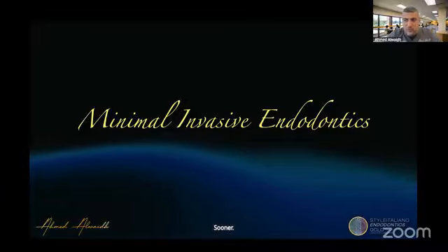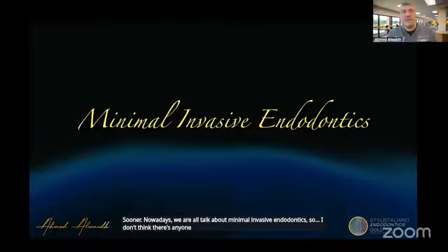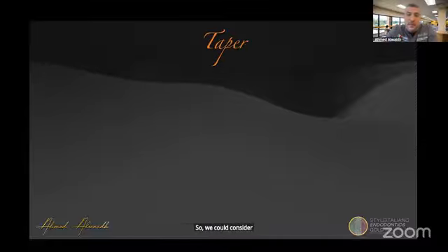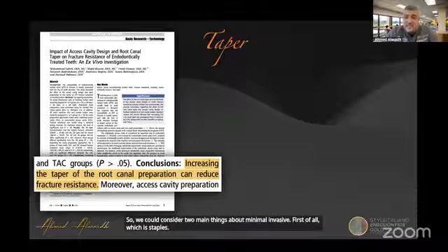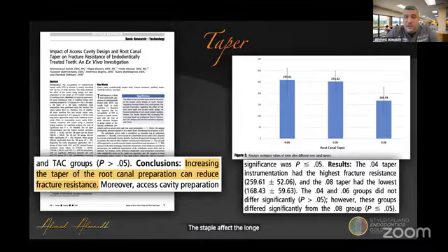Nowadays, we all talk about minimally invasive endodontics. So I don't think there is anyone nowadays using large tapers, taper 8, let's say. So we could consider two main things about minimally invasive. First of all, which is taper. Does taper affect the longevity of root canal treated teeth?